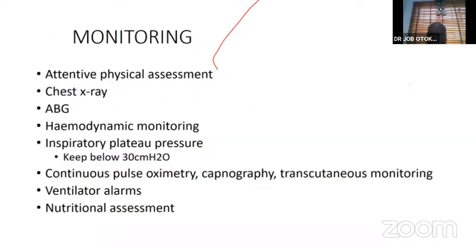Let's talk about the monitoring. What do you monitor when a patient is placed on a mechanical ventilator? Their physical presence is the key thing, your clinical assessment of the patient. You know the disease the patient presented with.